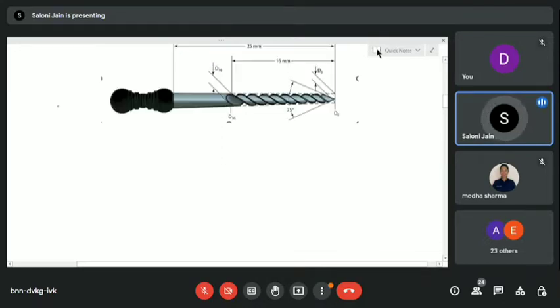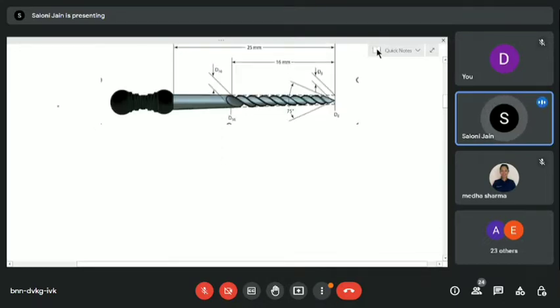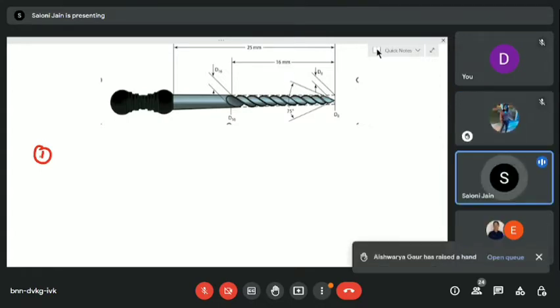If you see an instrument, that is basically a file or a reamer, the first thing that comes into mind is the various size, shapes, diameter, taper, these things. When you see an endodontic file, I hope everybody would have seen an endodontic file. Can I have in the chat box people who have seen endodontic files, reamers, or even people who have done root canals?